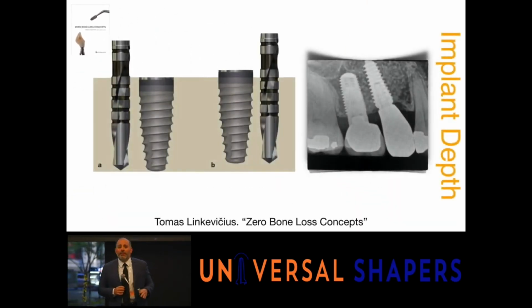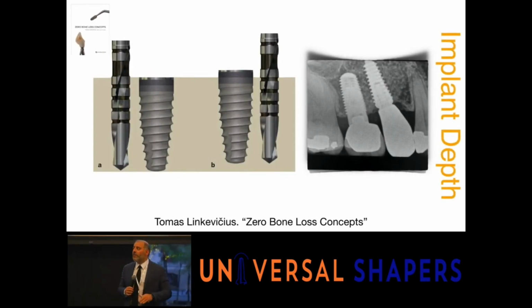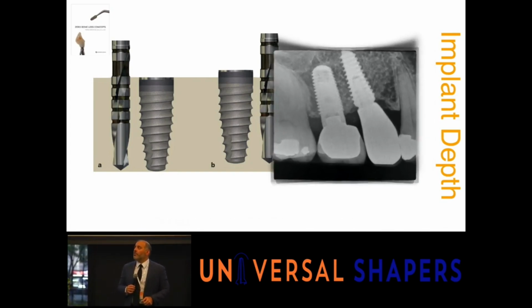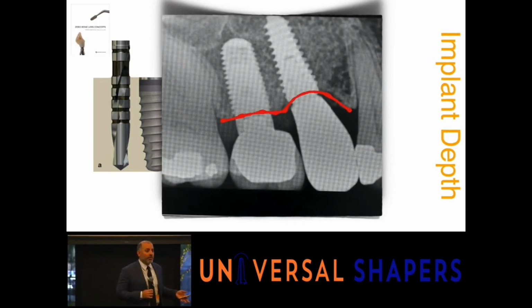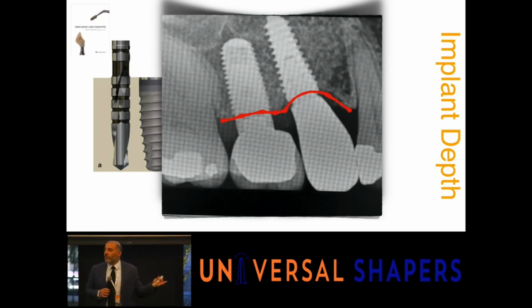He also speaks about the depth of placement. So we place it a little bit too high versus placing it a little bit lower, and we can get different types of response. So this patient came to my office, and this is in 2011. This implant, I won't name names over here, was placed in 2010, this one in 2011. And it looks like one has some bone loss on it and one doesn't, right? If you look at this implant here, looks like it's losing bone. And over here, it lost its bone, but it's up to the first thread, that typical dieback. Was it placed deep enough? That could be argued for over where it's placed in terms of the CEJ of the adjacent tooth.